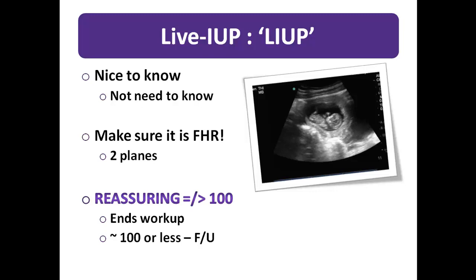As a final note, please be aware that the Doppler mode on your ultrasound machine should never be used in transvaginal assessments of early pregnancy, owing to transmission of energy to the embryo and possible risk of fetal malformations. Both B mode and M mode are considered safe approaches.